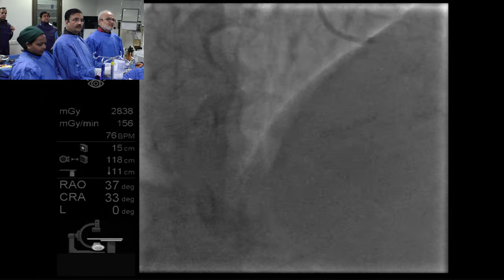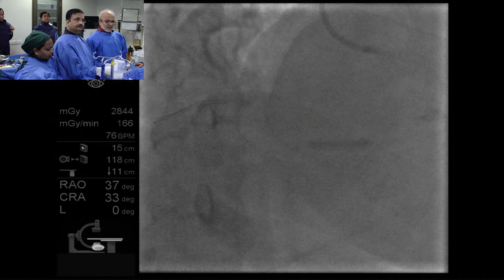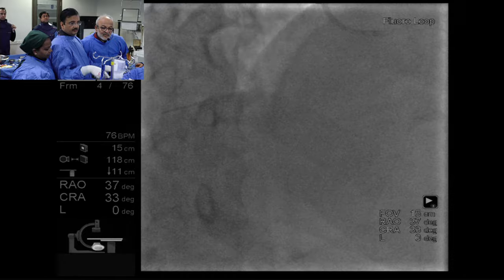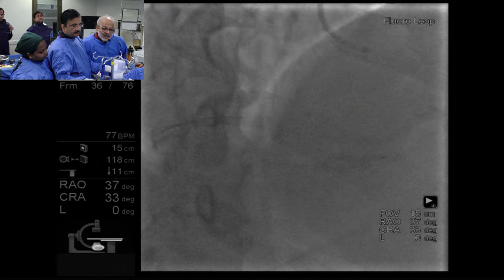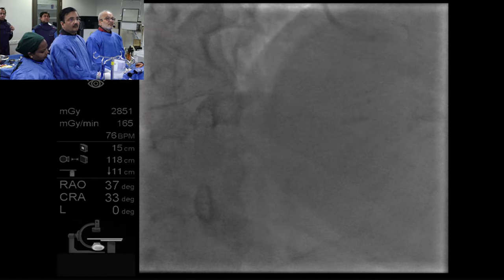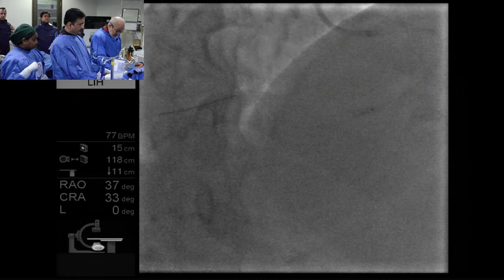15. The stent is inside the dot, right? Yes. 15. Maybe 17, 18. How much does it become? 2.75, 2.93. Okay, deflate. Tejas, your call on DCBs for such lesions?